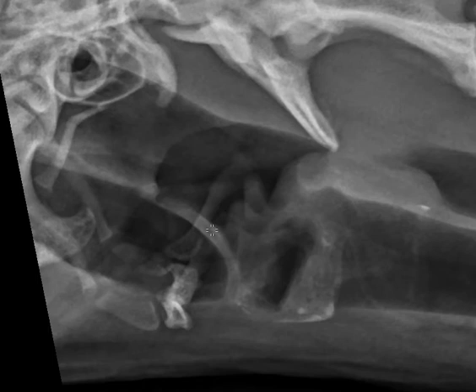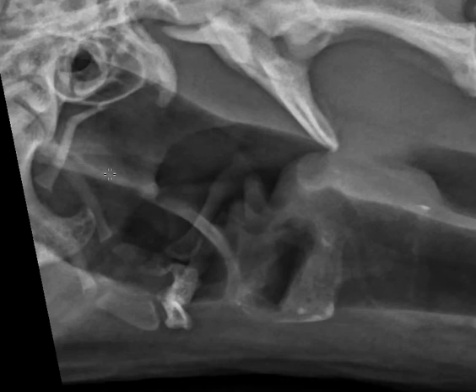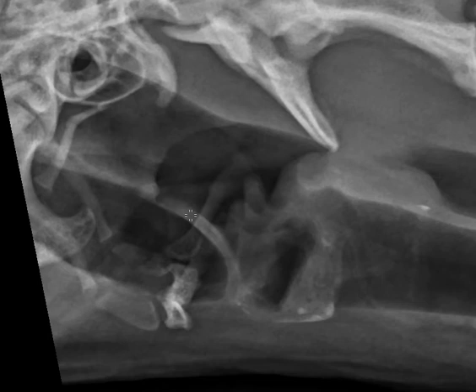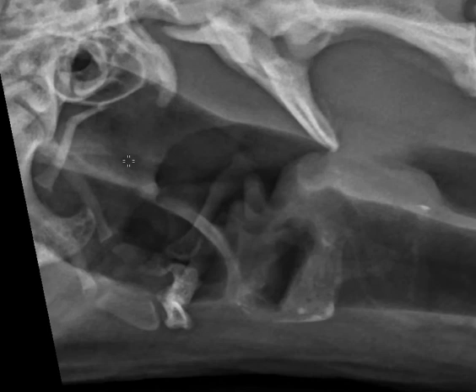The caudal edge of the soft palate often contacts or comes close to the epiglottis. This can vary with radiographic positioning, and it also can be a breed variation in dogs. The position of the epiglottis relative to the soft palate will vary depending on if the dog or cat is nasal breathing or oral breathing, and it can vary quite substantially. In this case, you can see that the epiglottis has a fairly neutral position in the middle, and that we have a decent amount of gas distension of the nasopharynx - the nasopharynx being that gas-filled space dorsal to the soft palate - and the oropharynx, the gas-filled space ventral to the soft palate.